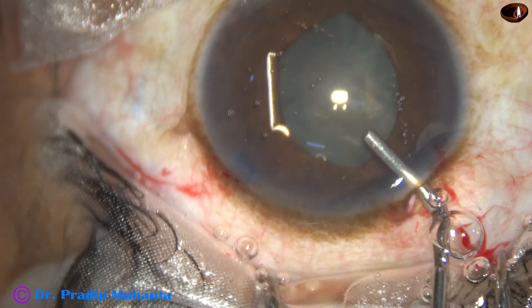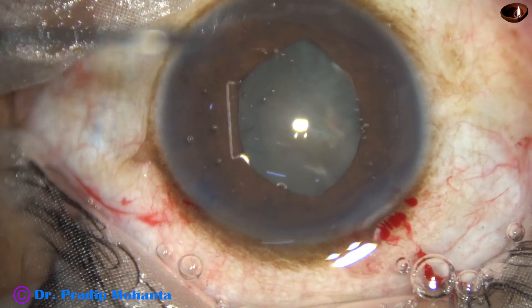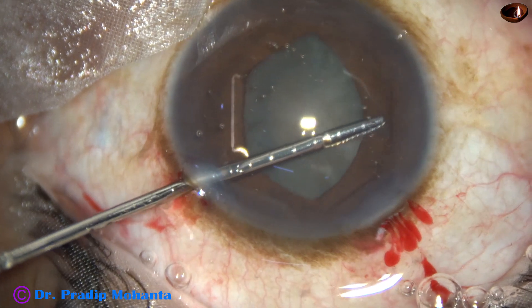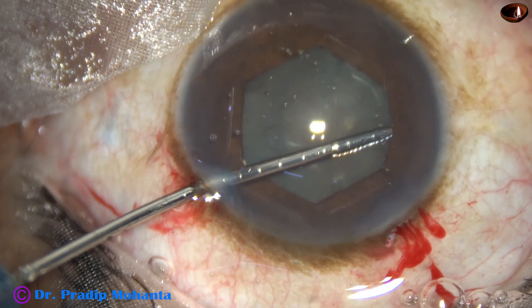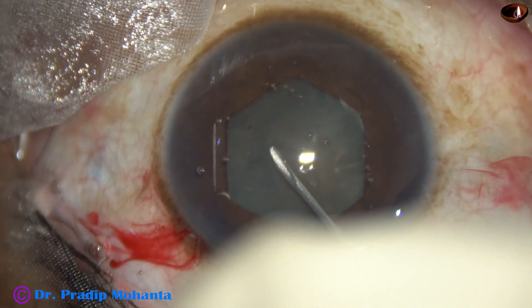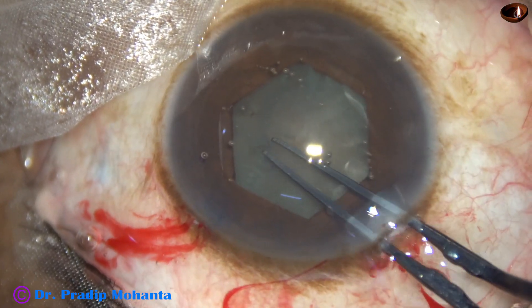An air bubble is decreasing visibility and is expressed out. The B-hex forceps goes through the side port — in this case there is only one side port — and the flange directed towards 10 o'clock is tucked. The pupil now takes a beautiful hexagonal shape, with a size of about 5.5 millimeters.